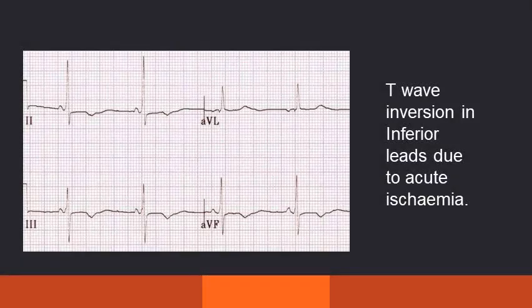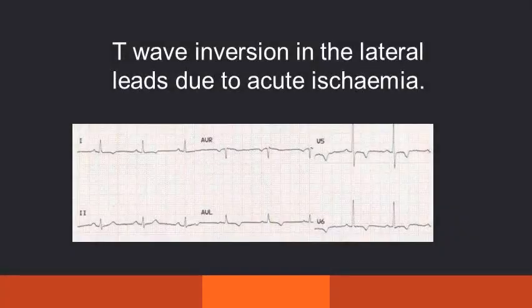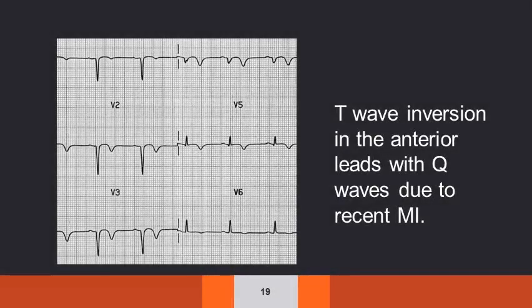In this ECG, T wave inversion is seen in inferior leads — leads 2, 3, and AVF — indicating inferior wall infarction. Here, T wave inversion in the lateral leads is due to ischemia in the lateral wall infarction. And T wave inversion in the anterior leads with Q waves is due to recent myocardial infarction.